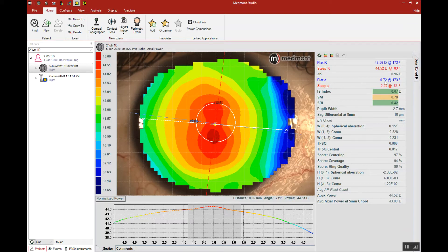The flat meridian e-value is 0.72, the steep meridian e-value is slightly less at 0.59. In other words, there's a higher rate of flattening across the flat meridian of the cornea. There's a lower rate of flattening across the steep meridian of the cornea, and that's why you have a difference between these two values.